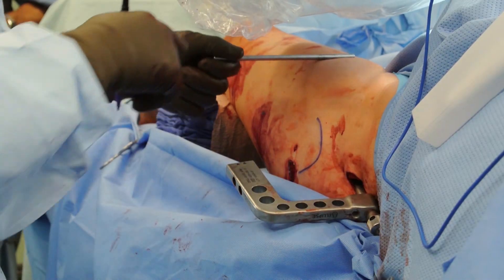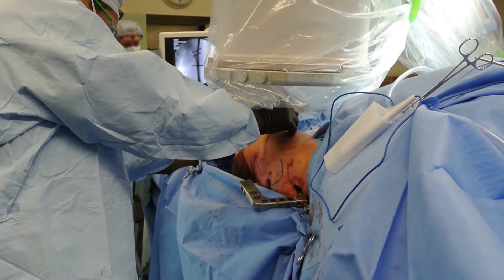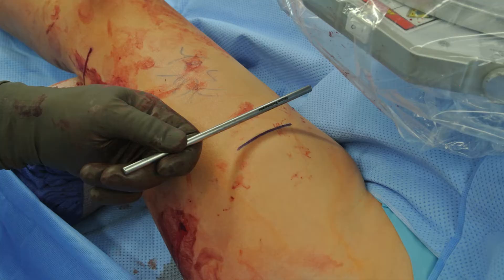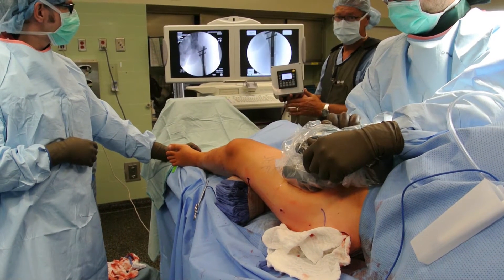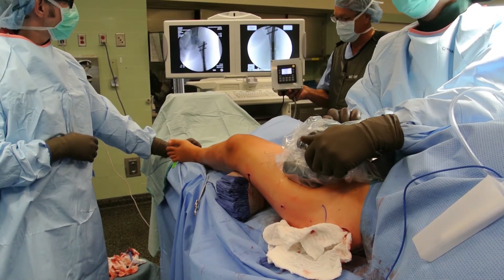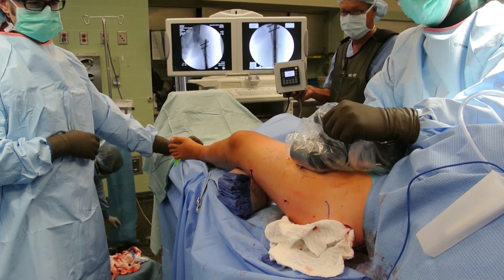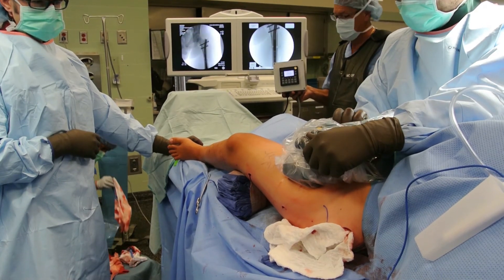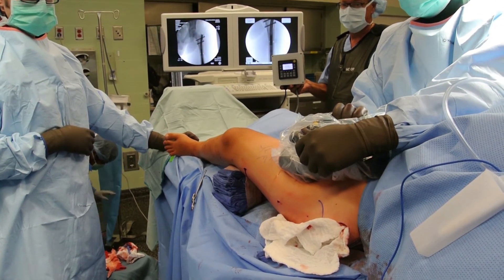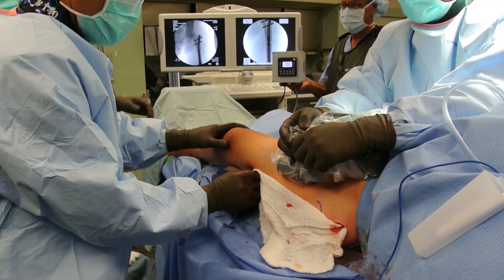The final step of this operation is to localize the magnet under fluoroscopic guidance. This is marked with an indelible marker on the anterior portion of the thigh. The patient must maintain the integrity of this mark throughout their lengthening process. The external remote control is then placed in a sterile bag and the first one to two millimeters of lengthening is performed prior to awakening the patient. A magnified view of the lengthening gear is obtained before and after this lengthening in order to confirm communication between the remote control and the internal lengthening mechanism of the nail.